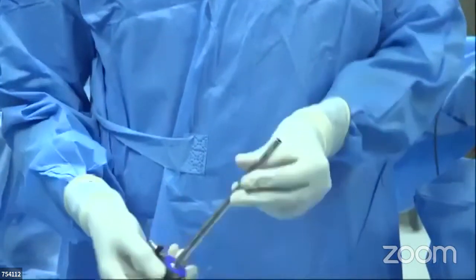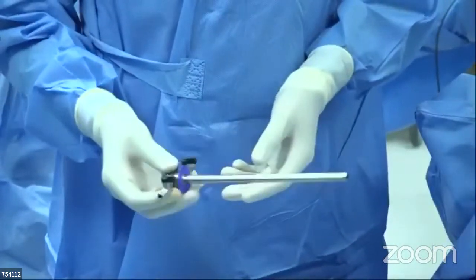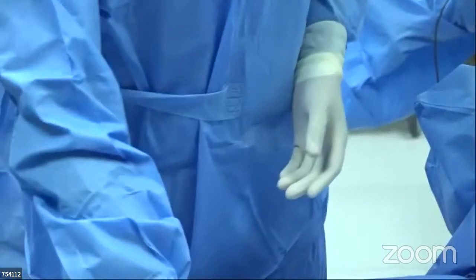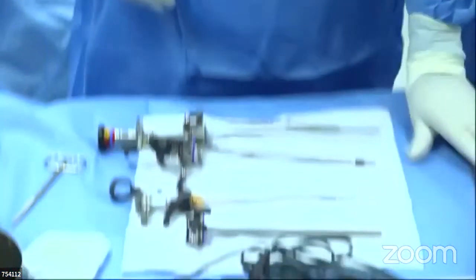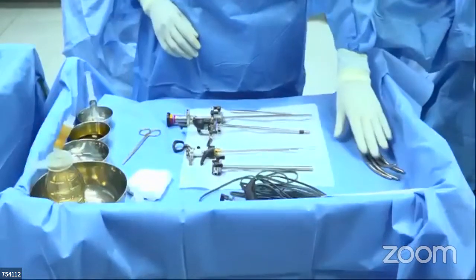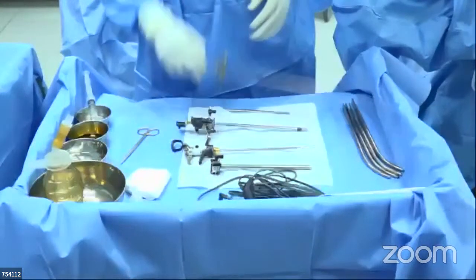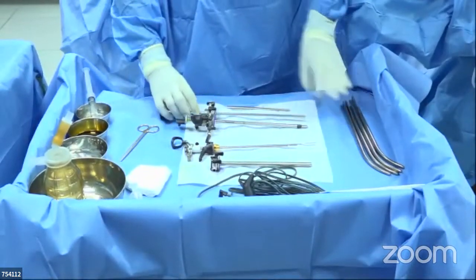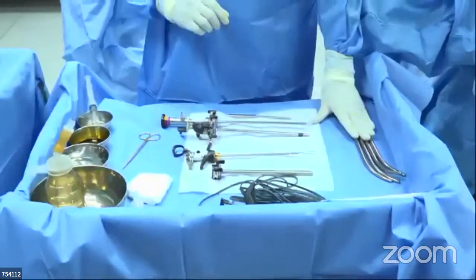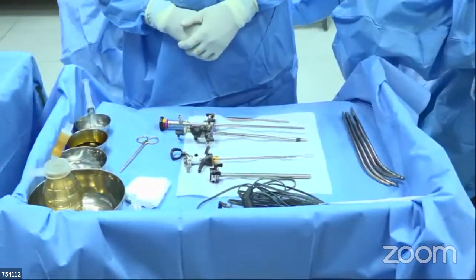These are 26 outer sheaths. In case there is a large gland, we think about continuous irrigation, in which case we'll be using this sheath over this. And we are using a bipolar TURP, so we have a bipolar cable and a dilator set. Dilatation of the urethra is not really dilatation most of the time. It is calibrating the urethra, which happens in the majority of cases. First of all, you do a cystoscopy. If there are any slight narrowings which we cannot call a stricture, you may need to calibrate with a dilator to make it a little open and pass the resectoscope after adequate lubrication.